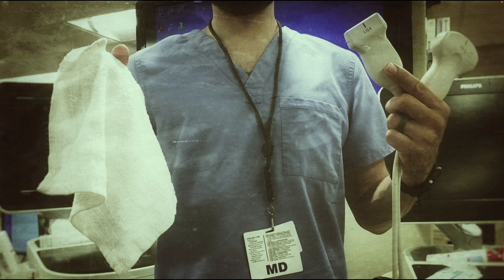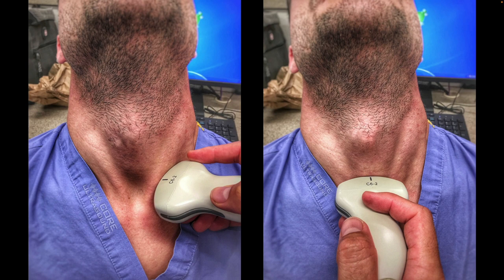Make sure that when you're using your tracheal ultrasound for intubation, you have a rag to wipe off the gel just in case you need external manipulation of that airway. With regards to actual placement of that transducer on the neck, you're going to place it either in the suprasternal notch or just lateral to the suprasternal notch. Most studies actually place it in the suprasternal notch, but personally I like finding the esophagus as my primary landmark, because that's what you're trying to make sure the tube is not going into. Normally that's going to be on the left side of the neck, but sometimes it's on the right side.